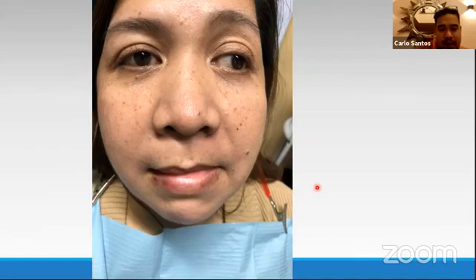So here, as you can see, there's a collapse in the ridge of the patient. Actually, she has no denture, and she doesn't like wearing dentures, and she's a little 50-50 about implants, but she doesn't like the collapse or the drooping of her lip. So we encouraged her to have a bone block ridge augmentation, using a block from her mandible.